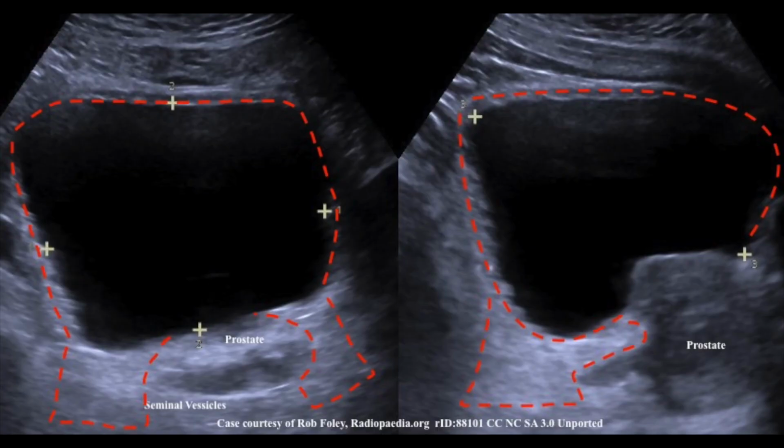This image demonstrates both the long axis and short axis view of the pelvic exam for the FAST exam in a male. So on the left is the short axis view, and you can see the prostate, which is posterior in the image, and that demonstrates where the fluid could be both laterally and anteriorly and posteriorly. The image to the right is the long axis view, where you can clearly see the prostate, which is the walnut-shaped structure, and this will demonstrate any fluid collections that are in the lateral distribution in the patient.